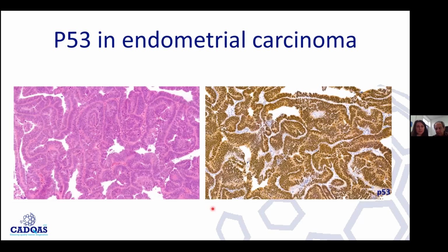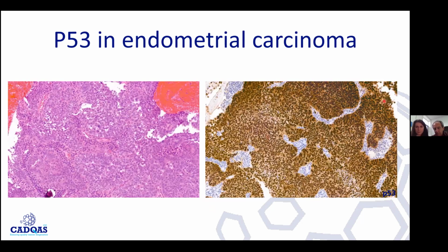Okay, then this is just an example to show the endometrioid morphology. This is an endometrial carcinoma. This is a more glandular area, and this is more solid. It has serous-like features in places, perhaps. And the P53 expression is wall to wall. It's very strong. This is the missense pattern we always want to see, although we're not always that lucky.